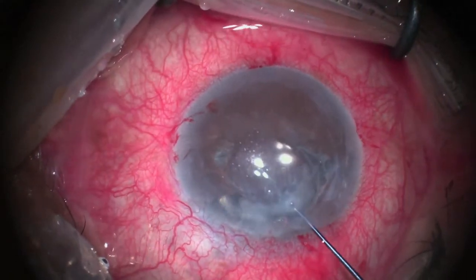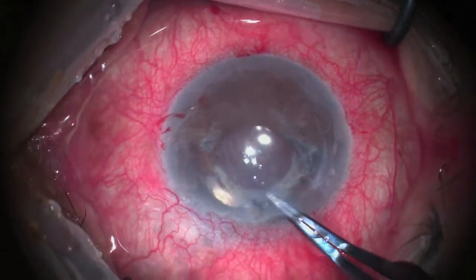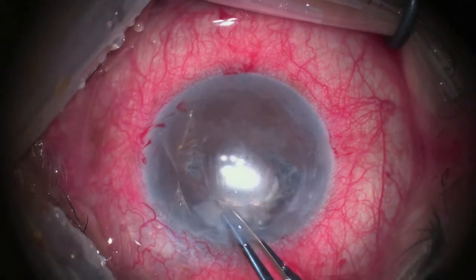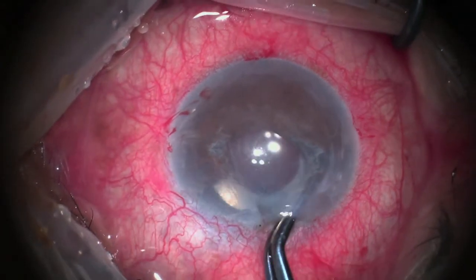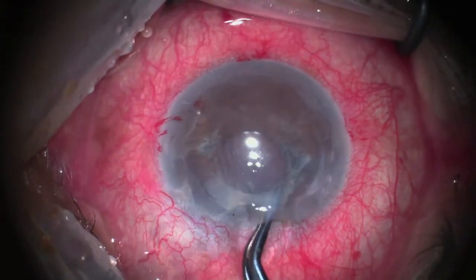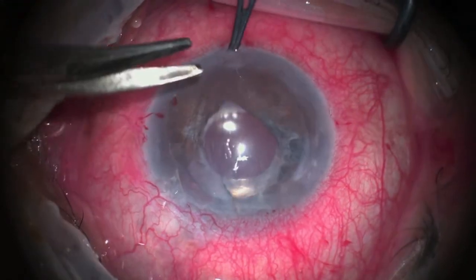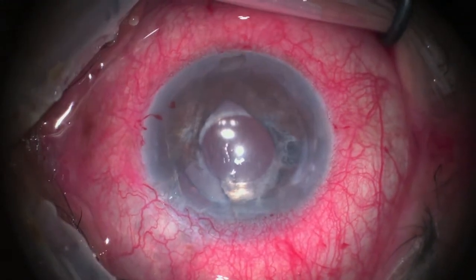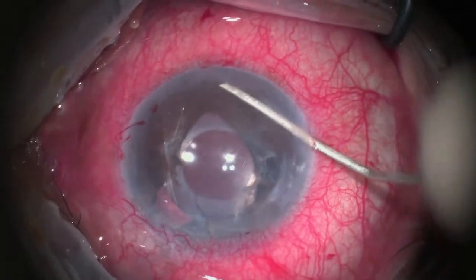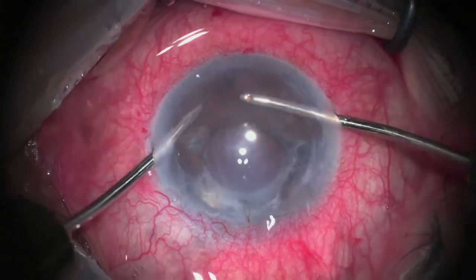After completing the process of stripping, a trial to approximate the iris edges is done for a trial of suturing. However, the defect is too large to be repaired. Now an inferior peripheral iridectomy is done using scissors. After that, I usually introduce a spatula in the created hole to make sure that the iris was cut full thickness.